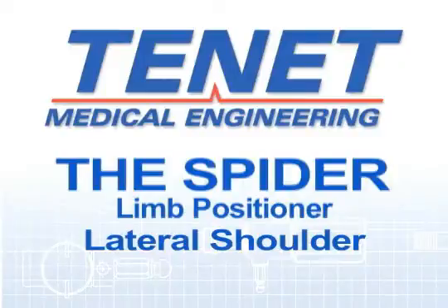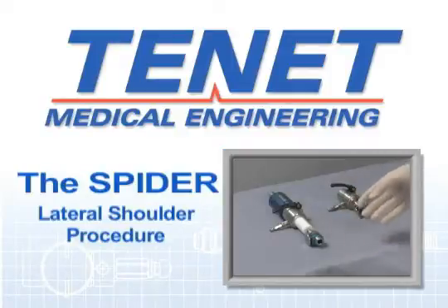The lateral shoulder procedure is similar to beach chair surgery in terms of how to wrap the arm and most of the parts used. However, there is an additional accessory bar that is used. Either the traction accessory or the 90 degree connector is used.